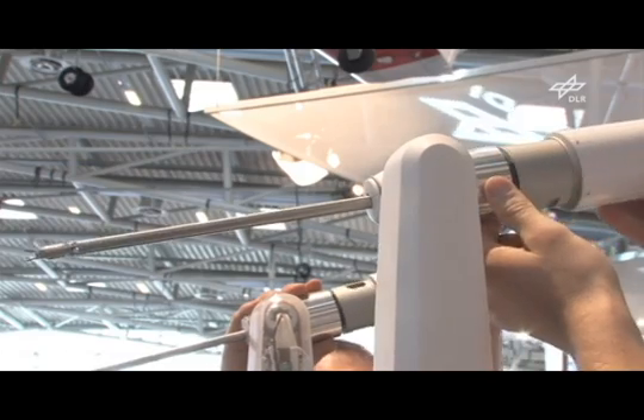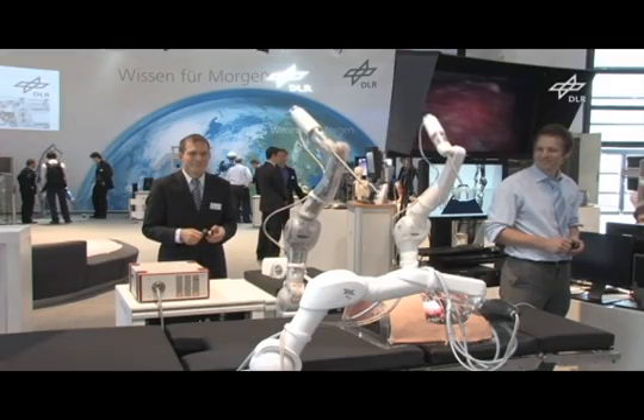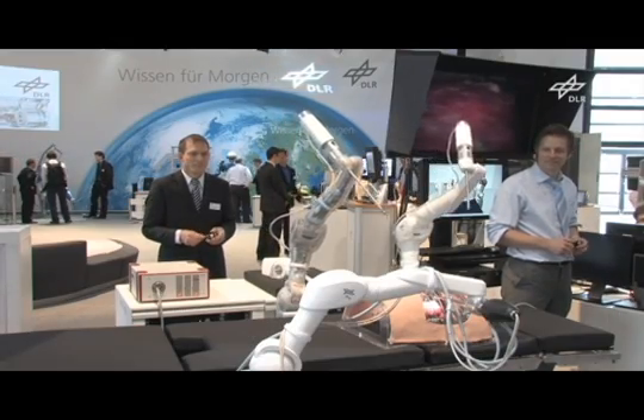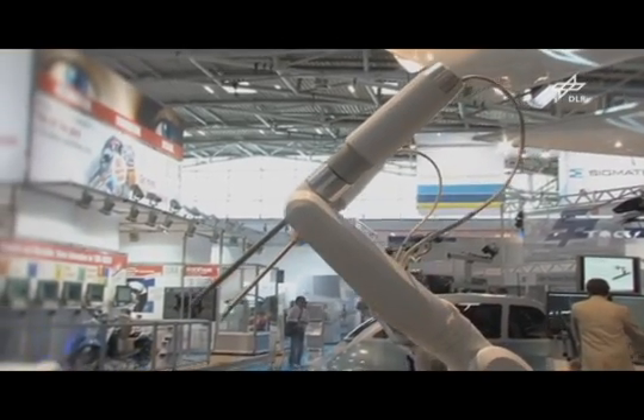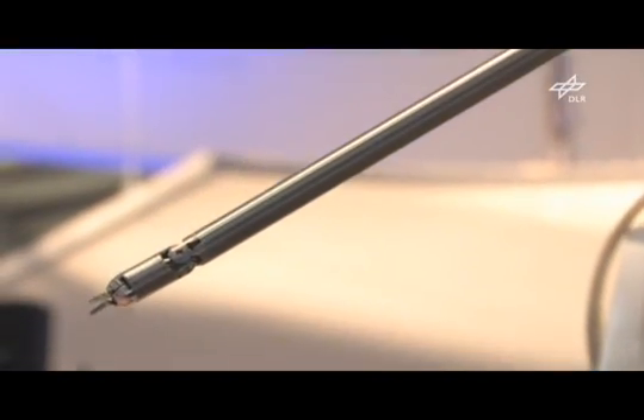All actions will be done remotely by the surgeon. Using the three robots, instruments and cameras will be positioned inside the patient's body. The instruments can be angled, which provides them with a very high degree of freedom inside the patient.